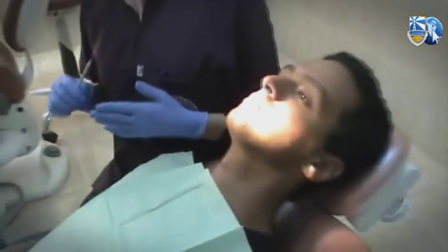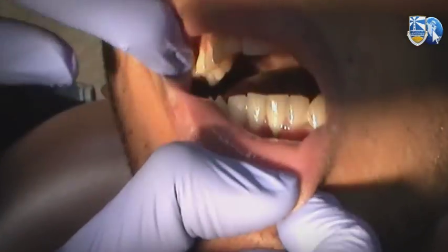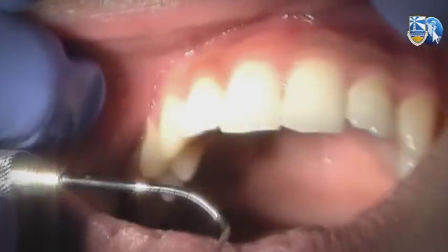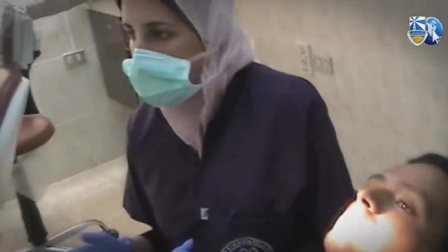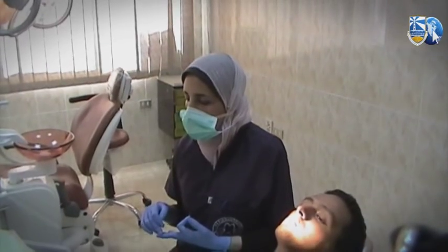The next item is recession. When do I say there is recession for a certain tooth? I have to see clinically the cementum — I have to see the root. I can't see any roots here, so there is no recession. If recession is present, I have to state which tooth has the recession, whether it is buccally or lingually, and the grade of the recession according to Miller's classification.